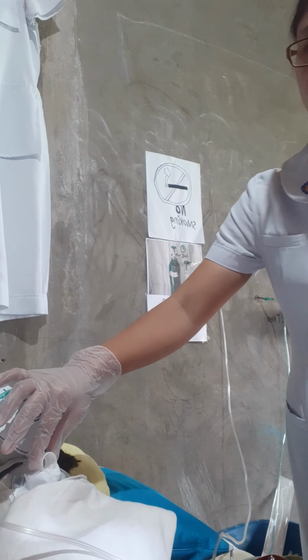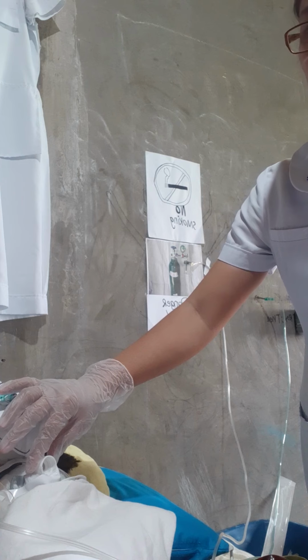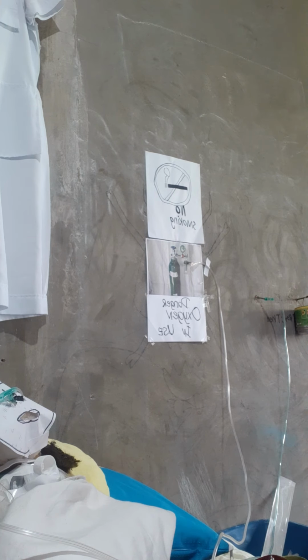And replace the oxygen source. Then we need to remove the gloves. Next, for cleaning the inner cannula, first we need to put on sterile gloves.